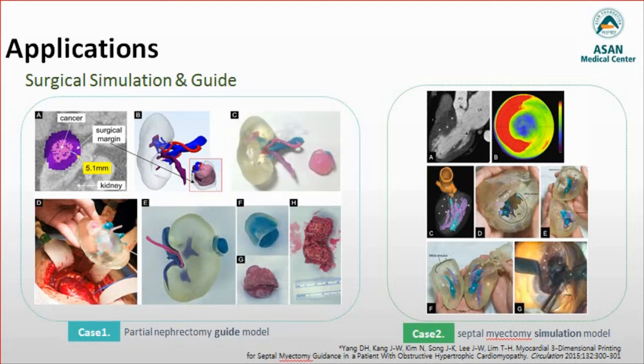All patients with renal mass were modeled by in-house software, which also reformats the renal anatomy and renal mass, and measured each volume. The virtual resection simulation followed an adequate safety margin with a 5 mm distance away from the renal mass. 3D printed kidney phantoms were fabricated by using a 3D printer.